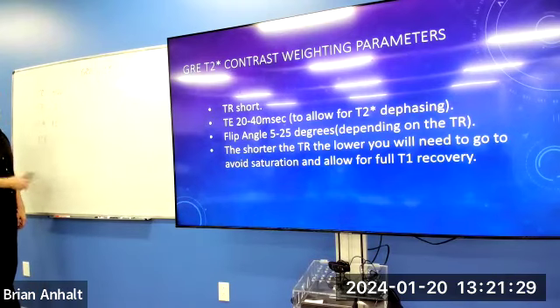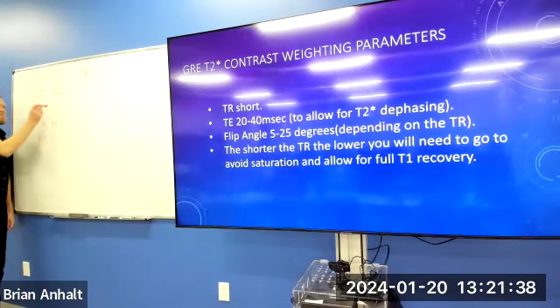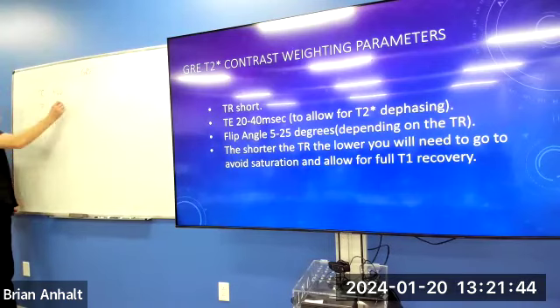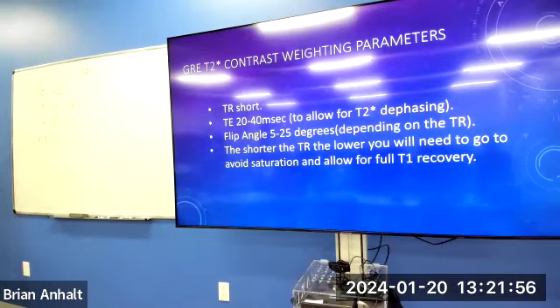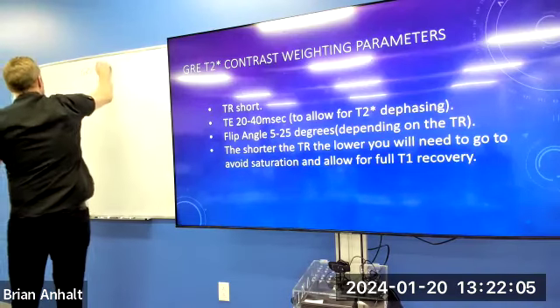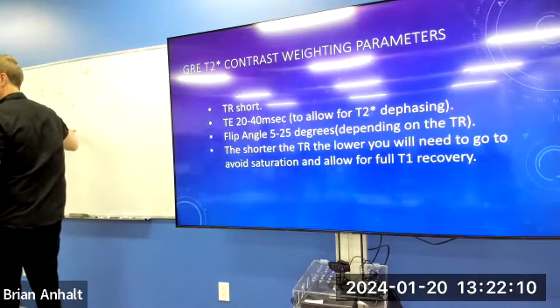Still a gradient echo sequence, right? We already know that because there's no refocusing angle. Long or short TE? Short. We're eliminating what? Yeah, so T2 star. High or low flip angle? Low. What have we eliminated? What do we get? What's the last one? I heard it. PD. Proton density. Right? Eliminated T2 star. Eliminated T1.